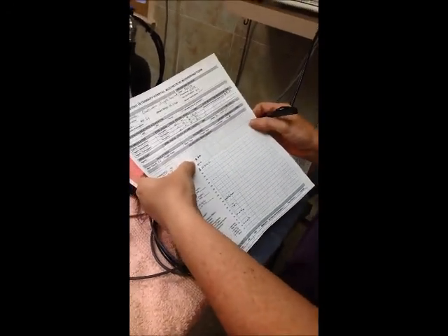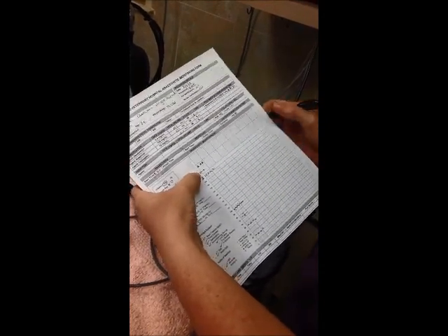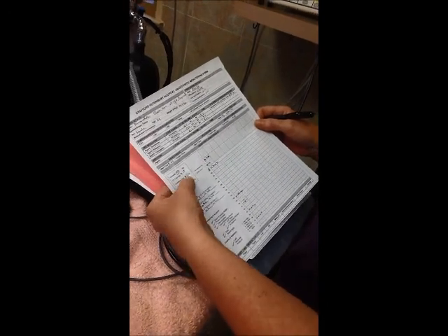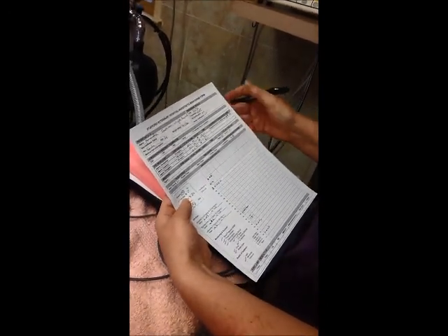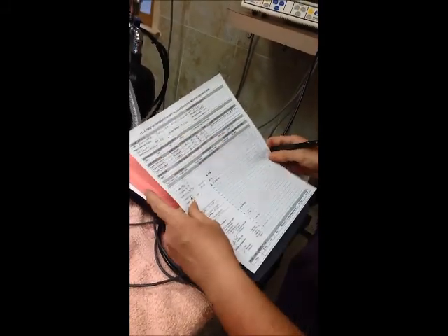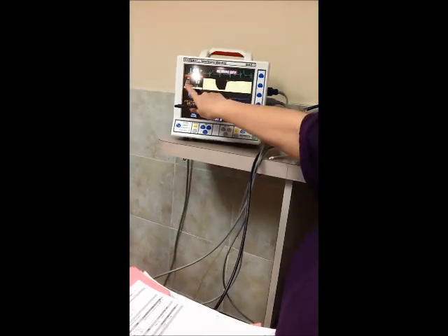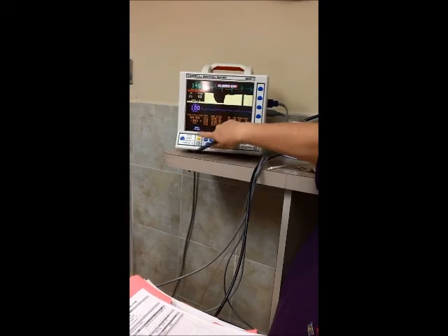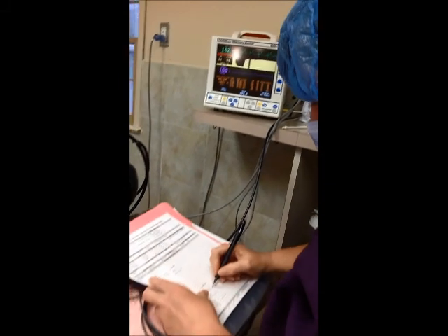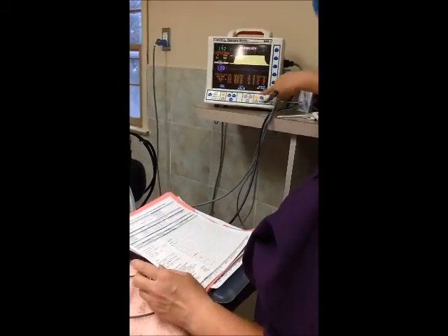She's been on 3 the whole time of the procedure, and her oxygen is on 1 because we have low flow oxygen here. She has a 4 E-tube, and we intubated her at 820. She'll be extubated shortly. She got her pain medication. These were the pre-meds that were used, and you can see up here that everything pretty much coincides: the respirations, the EtCO2, her oxygenation, and her current blood pressure, along with her temperature.